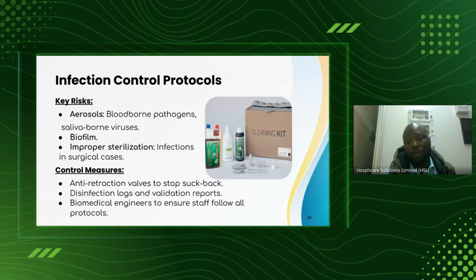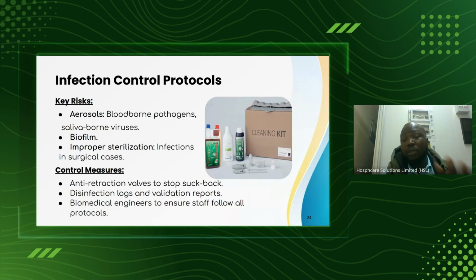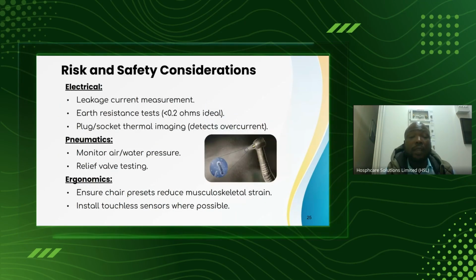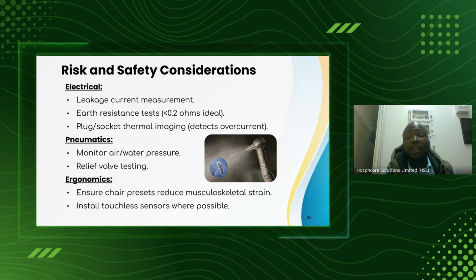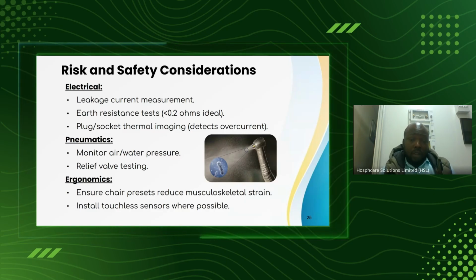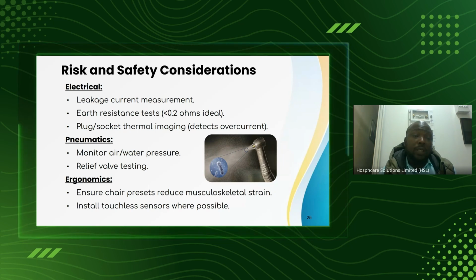These protocols are very important, even for cleaning of the filters. Some users don't like touching these filters because they know they carry a lot of infection. So they leave them like that. Then things clog, and they call you to come and do the maintenance. But you should make sure that they follow the protocols on how to follow the procedure and clean the filters and everything.